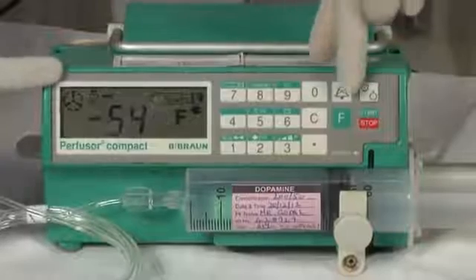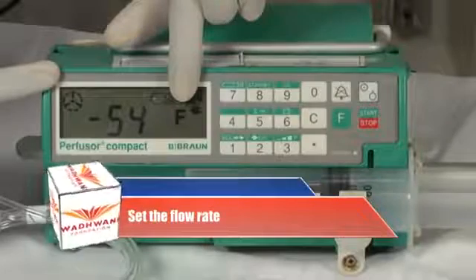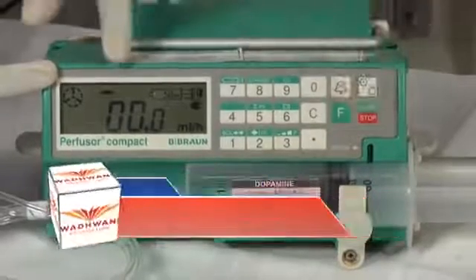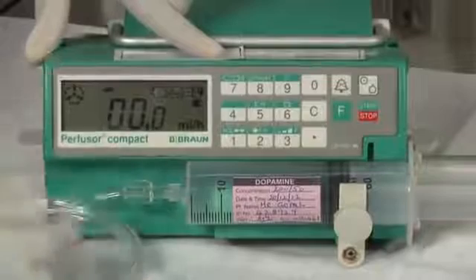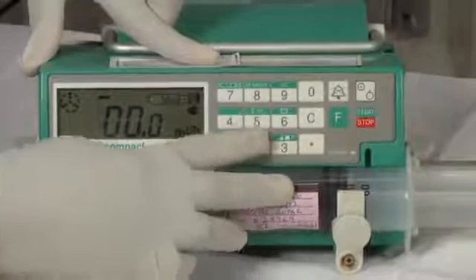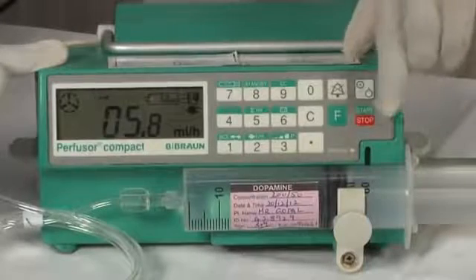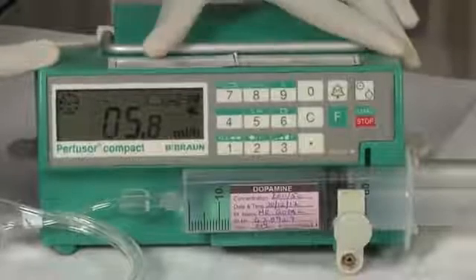Turn the alarm off by pressing the alarm button. Set the flow rate. F is the function key. Press the F key which now allows you to enter the flow rate using the number keys on the keypad. We had calculated the flow rate to be 5.8 millilitres per hour earlier. We will now enter this into the syringe pump. Now press the start button. The pump is now ready to start the flow of the drug solution at this rate.